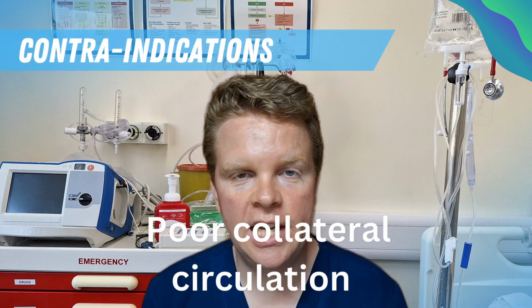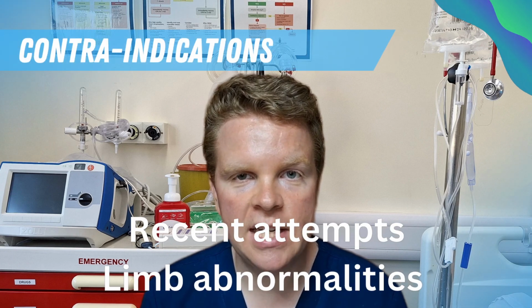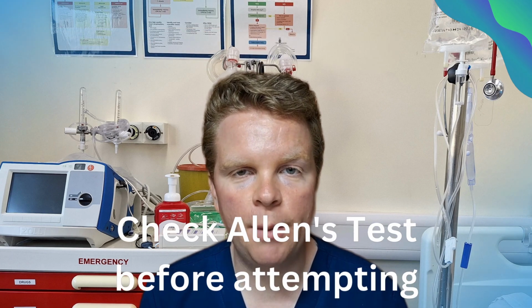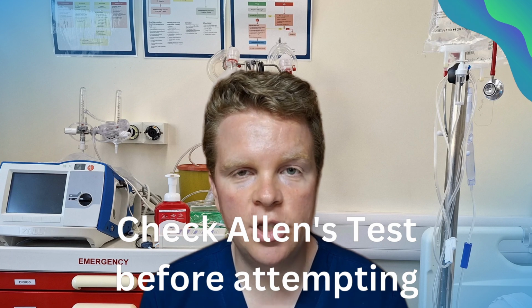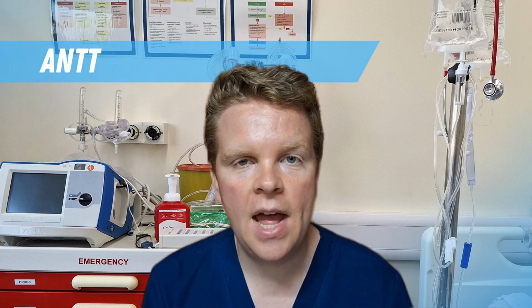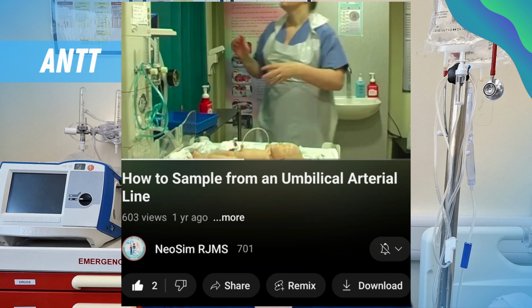Arterial lines are contraindicated if there is poor collateral circulation in that artery, if there are signs of poor circulation, there has been a recent attempt in that artery, or if there are severe limb abnormalities. Always perform Allen's test before performing a peripheral arterial line. Uncontrolled coagulopathy is also a contraindication. Strict ANTT is required when inserting and also when accessing an arterial line. This video by Neosim shows you the correct technique for accessing an arterial line.